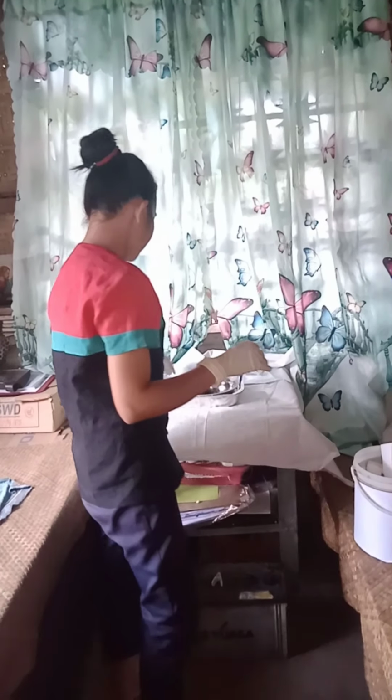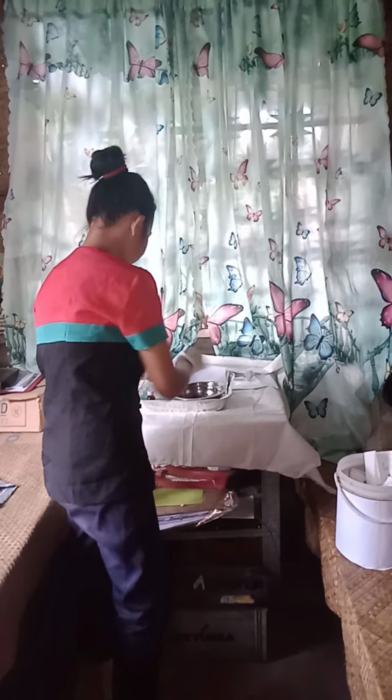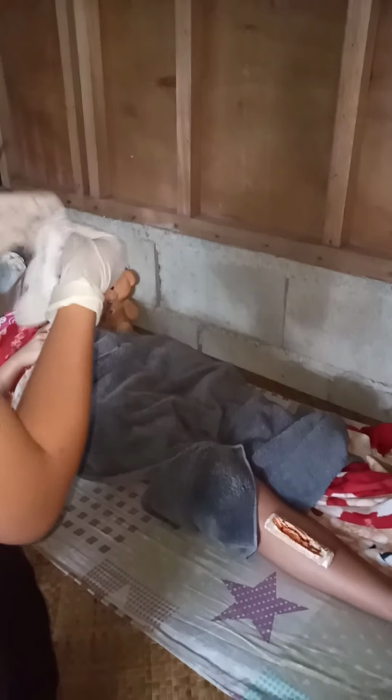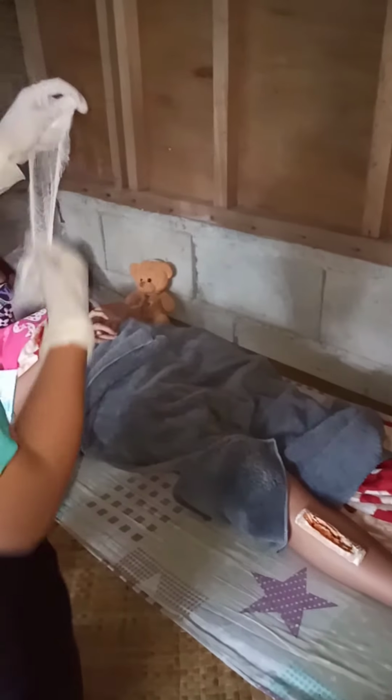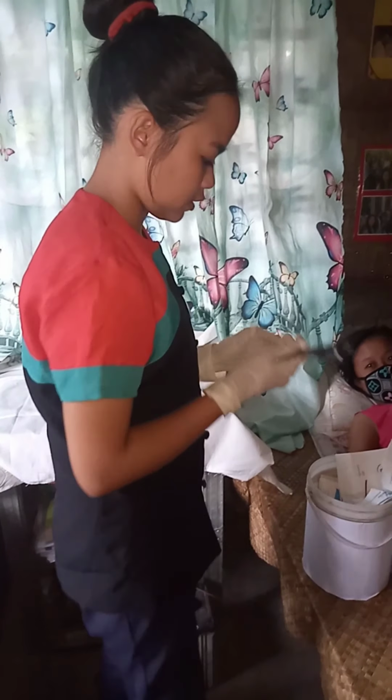Then, after that, it is the time to apply loose woven gauze as a contact layer. Make sure to open it. You can also use your forceps to dip it in the solution.